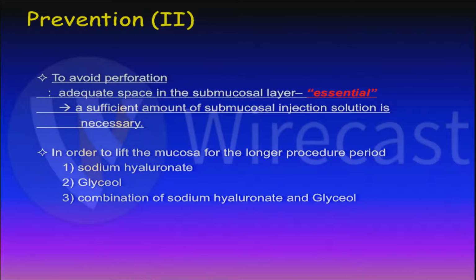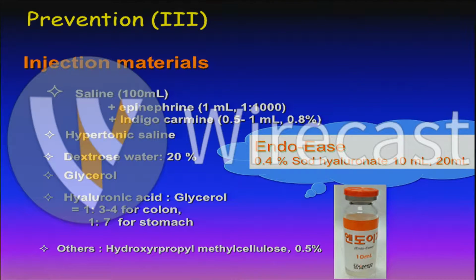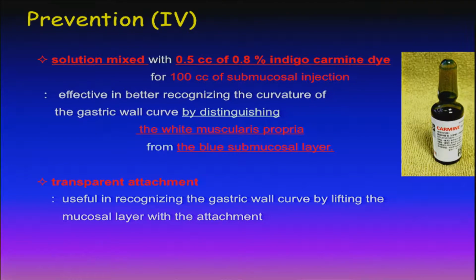She already introduced a lot of injection material. Hyaluronic acid is best, but relatively so expensive. And I used injection solution with 0.5 cc of 0.8% of indigo carmine for 100 cc of saline and epinephrine solution.